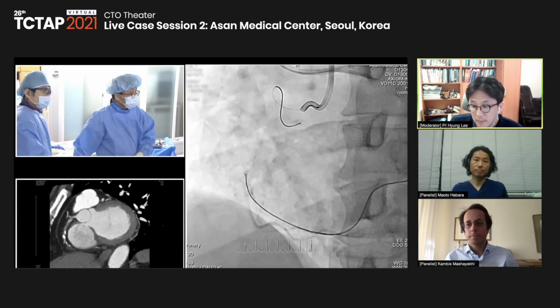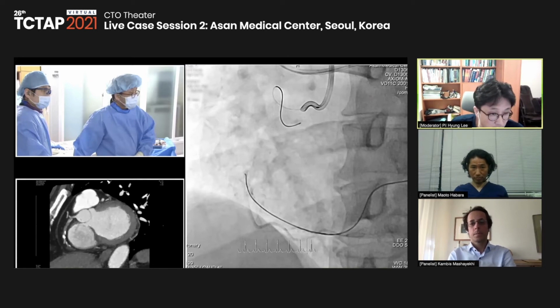And the second one is that anatomically, I'm really sorry that I could not prepare the septal anatomy here, but there was lots of tortuosity at the distal portion. So according to my experience, I thought that it would be very unfavorable and I would waste my time regarding the septal wiring.